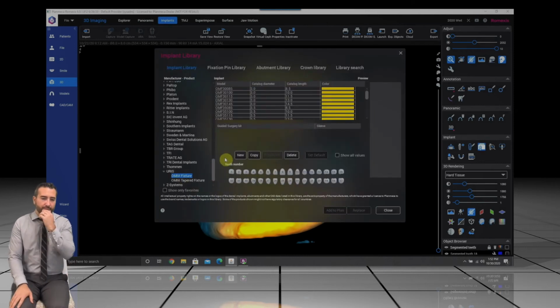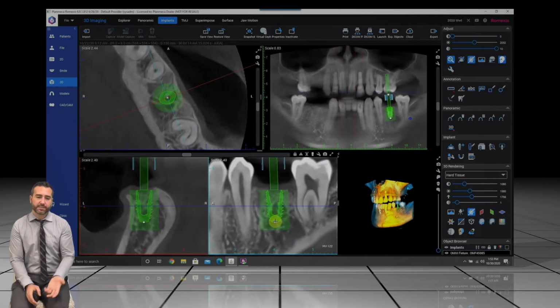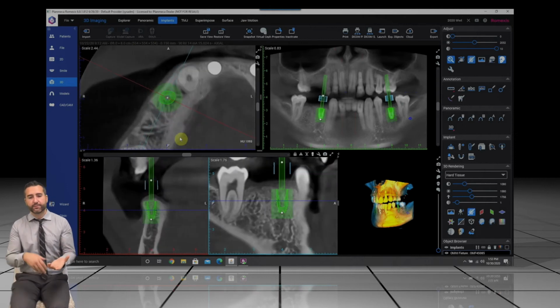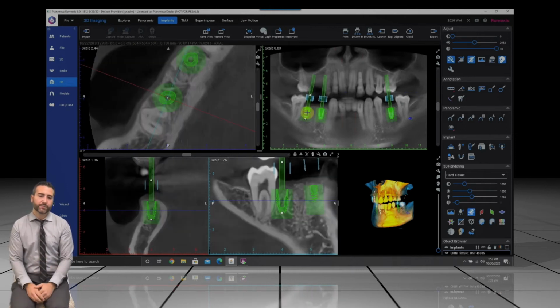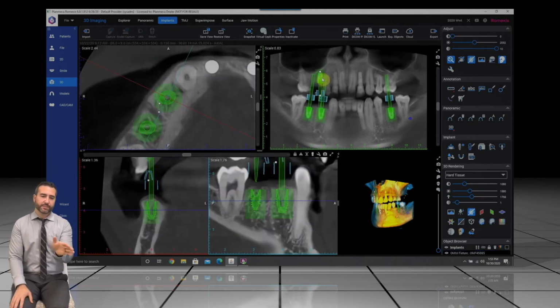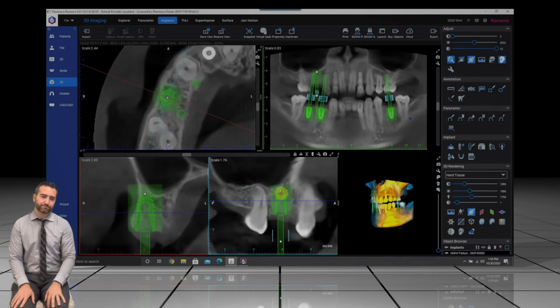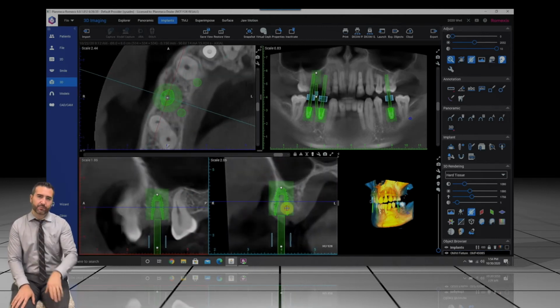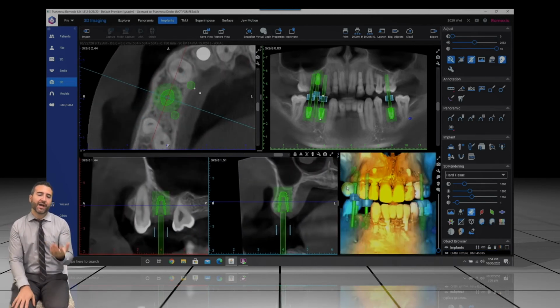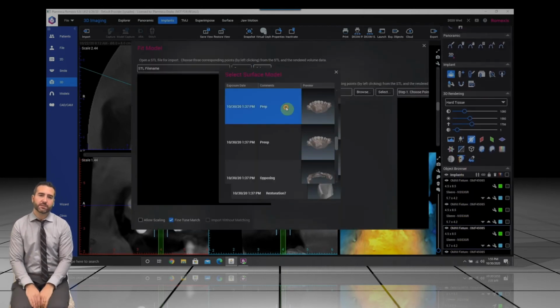And so now here in this particular planning software, I'm just throwing in some implants. There's hundreds of implants to choose from. We could do fully guided, we could do pilot guided, we could put various different types of sleeves on, but the patient's sitting here and I'm throwing these in here really quick and telling them exactly what we're going to need to do, whether or not we need to do a sinus bump or not, and the patient's blown away. You have to remember they've been through several consults, nobody sat down with the patient and did this with them.